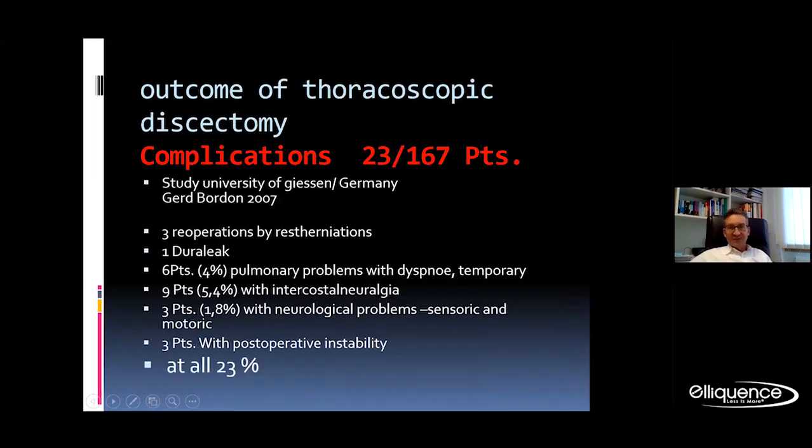But never forget, there was a huge study for a doctoral degree in Germany, and there is overall a rate, I don't want to say always complications, of unexpected events up to 23%. And so the decision for the transthoracic approach should be made very carefully.